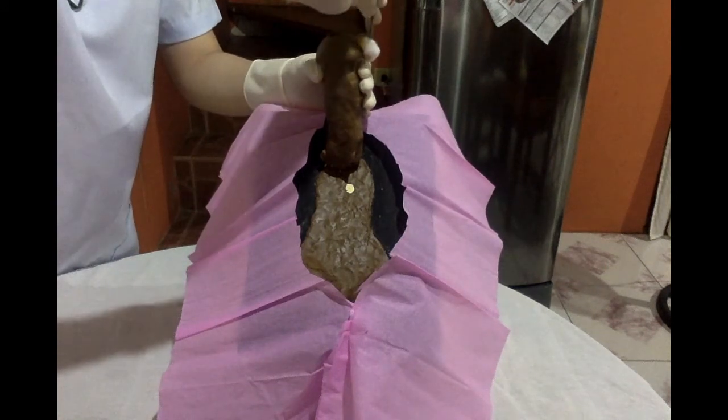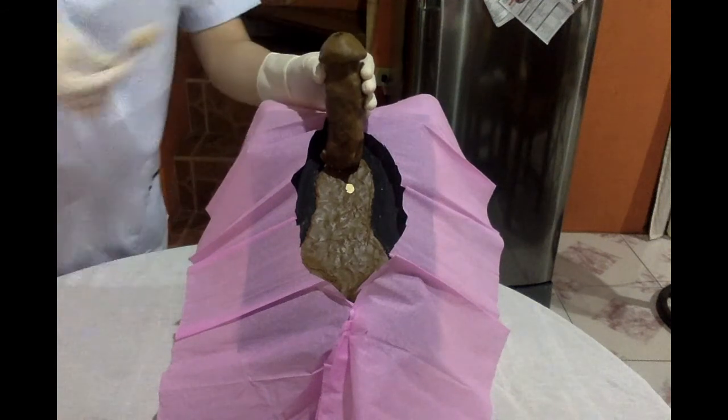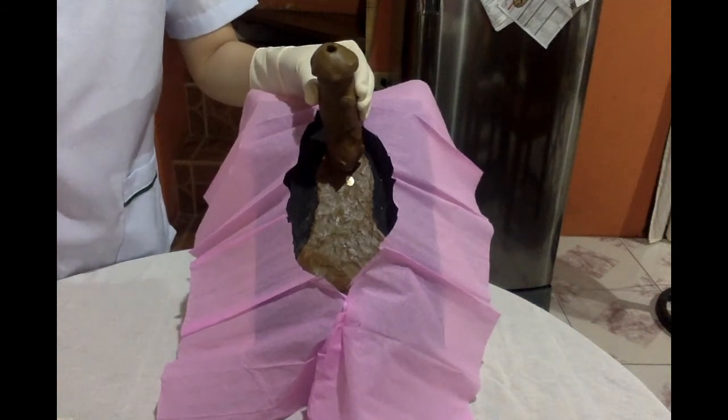So after each wipe, we will discard the cotton ball. So in this way, I am able to cleanse the meatus without cross-contaminating or contaminating the sterile hand. Then, after all the cotton balls have been used, I will discard the forceps to prevent contamination of the sterile field.